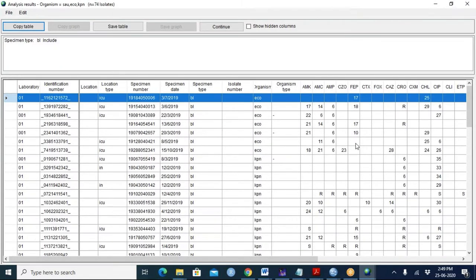Okay, good. So yeah, you know the reason? Yes. Originally, the code was 001. Later on, we just created a new laboratory with 01 only. So while we are merging the two data, you'll see two kinds of laboratories. Yes, that's perfectly fine. It is a bit inconvenient. So I will also show you how we can change it so that all of them are 01. This is an example. Thank you. Click on continue. Click on continue.